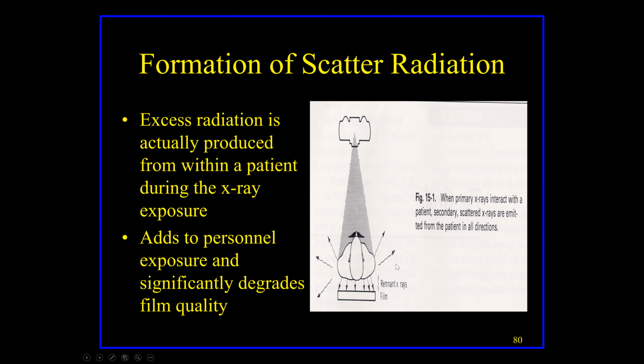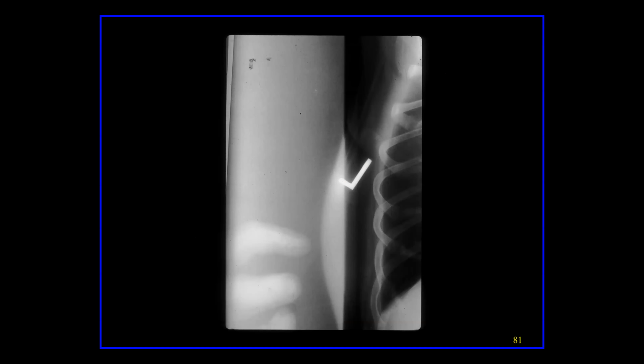Again, that's the part that gets you into trouble radiation safety-wise when you don't wear your lead gloves. It's not generally the primary beam, because, except for that X-ray I showed you yesterday, most people are smart enough to keep their hands out of the primary beam. So scatter radiation is a big deal. And again, there's a picture of that image I show you. They're being exposed by scatter radiation coming from the patient, not by primary beam radiation that comes from the X-ray tube.